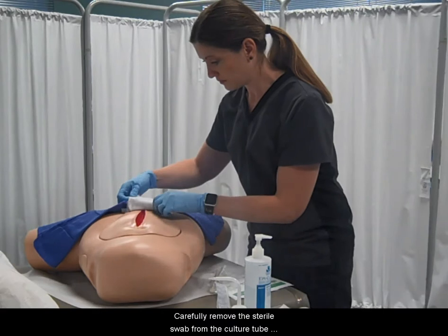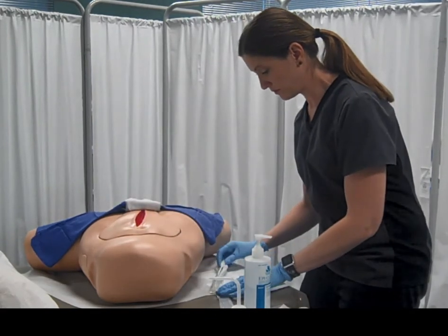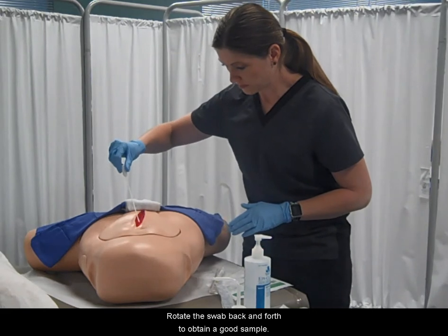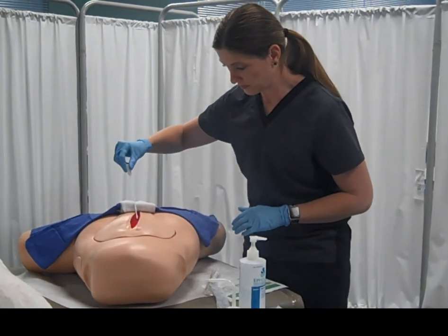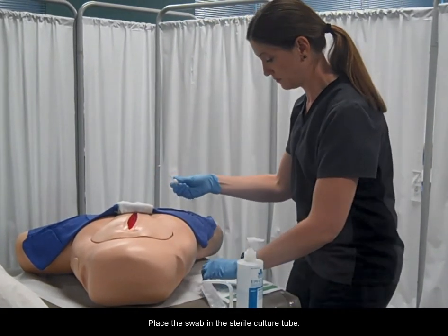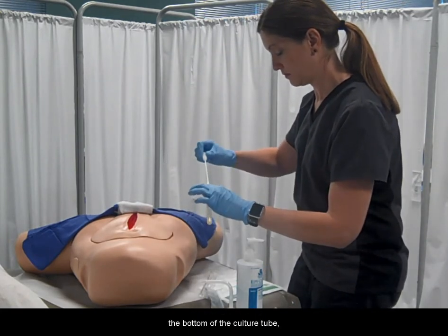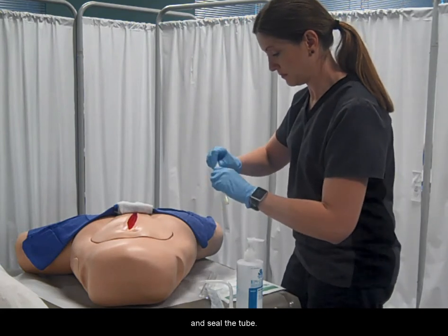Carefully remove the sterile swab from the culture tube and place it in the wound. Rotate the swab back and forth to obtain a good sample. Place the swab in the sterile culture tube, crush the ampule of preservative that is found at the bottom of the culture tube, and seal the tube.